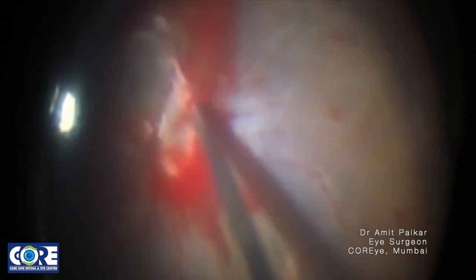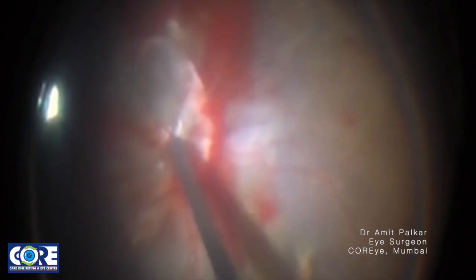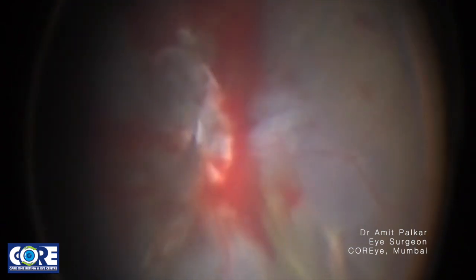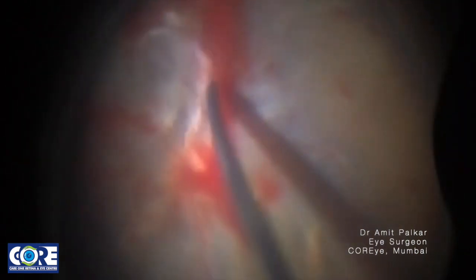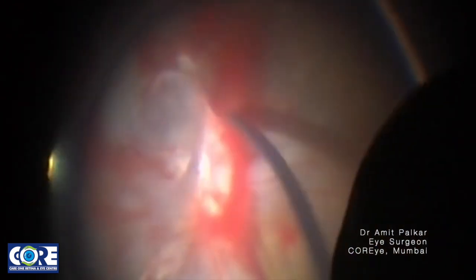It is indeed time consuming to intermittently clear off the bleeding, the clots. These clots form a membrane over the retina again, which consume more time to get released and peeled off. Blunt spatula sometimes comes handy when we are dealing with larger neovascular fronts.